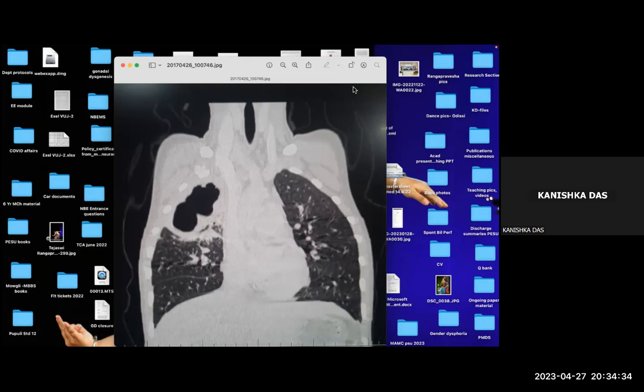If I had given you some coronal, sagittal and other pictures, lateral views and all, and you had seen it in the posterior mediastinum, maybe you were justified in saying that. But just with one picture, that need not come so high in the differential diagnosis. So tell all the common things first and point out the limitation of the picture that you have been provided. You can only read as much as is shown to you. You can't read more. Understand?